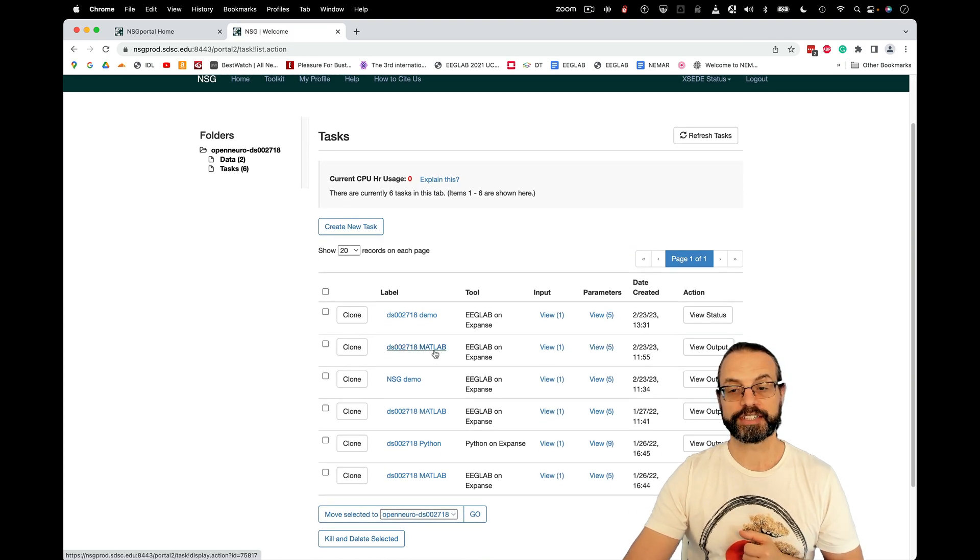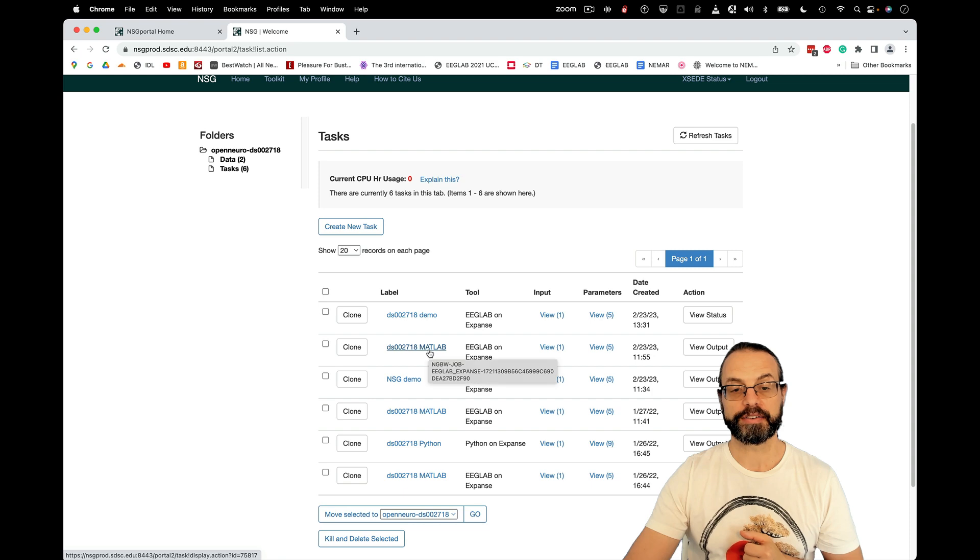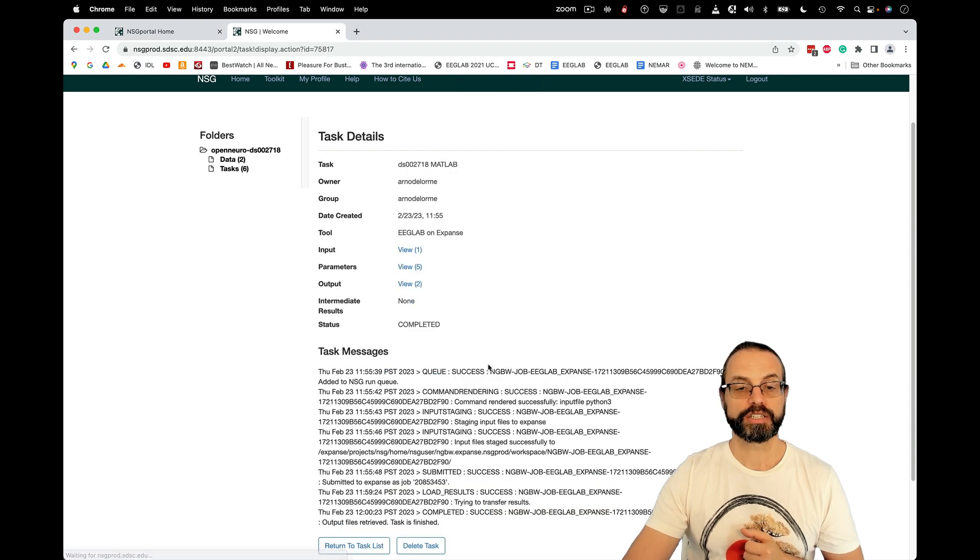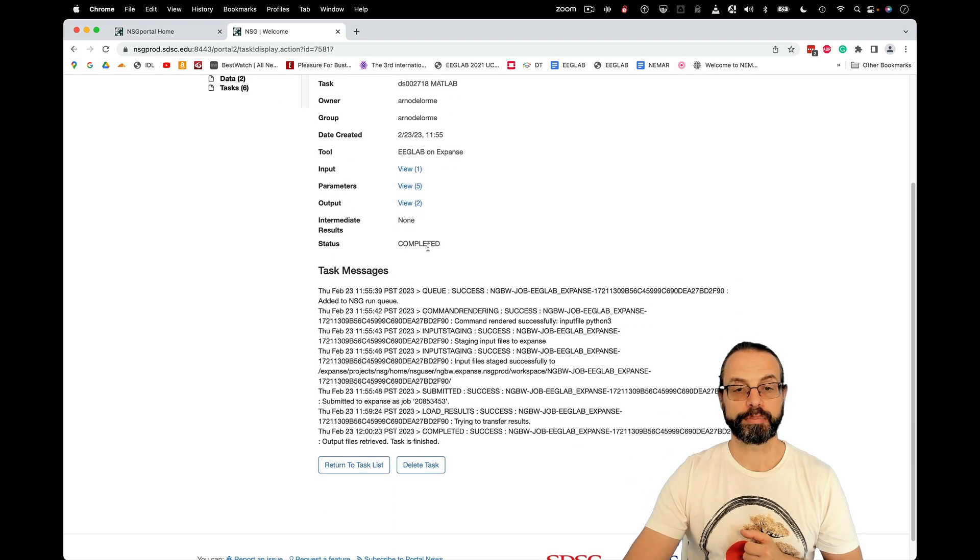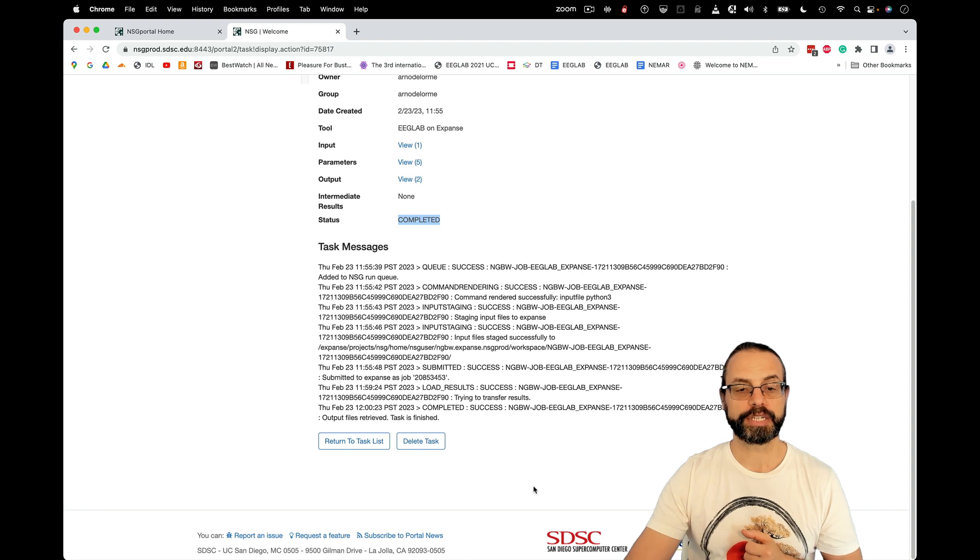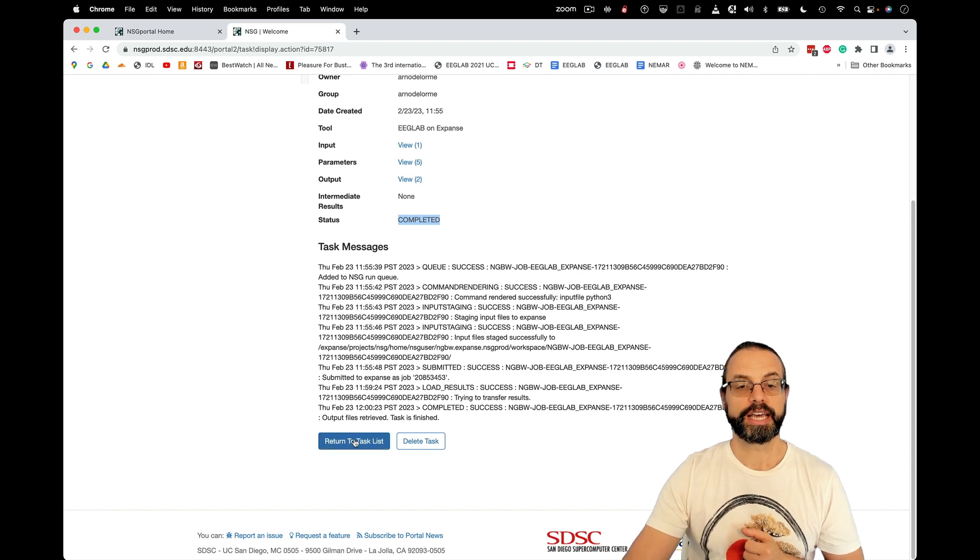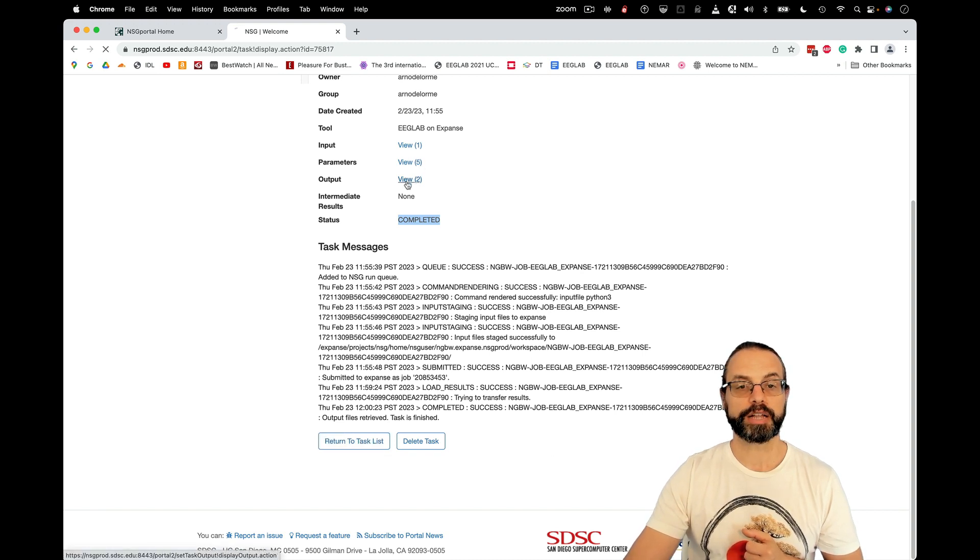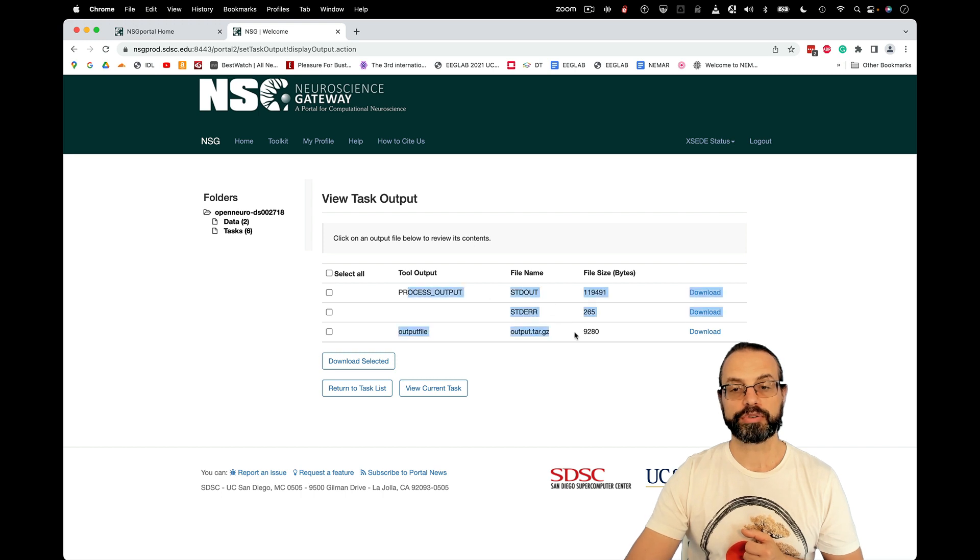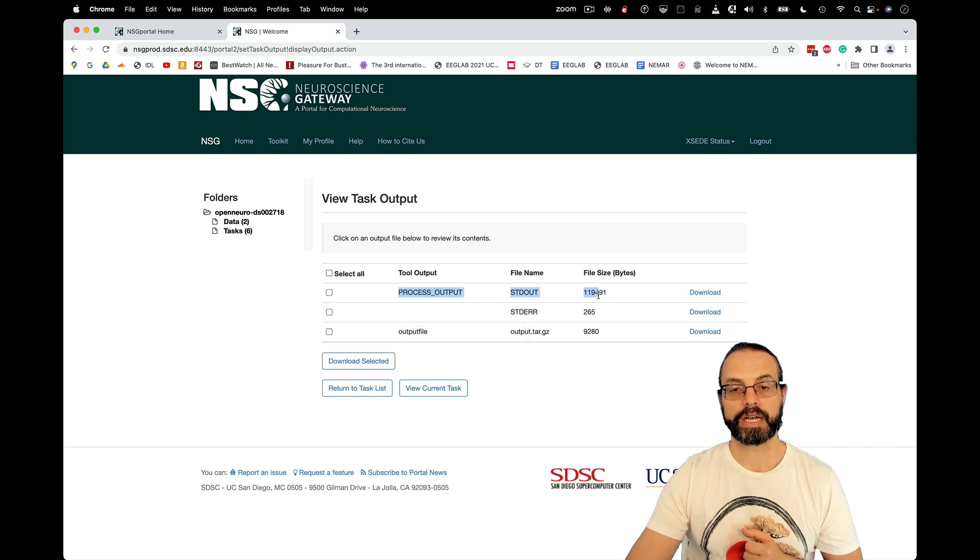So I can just show you the results right here. And for example, on this one. So this one says completed. I just ran it like 10 minutes ago and I can view the output. So you have three outputs here.